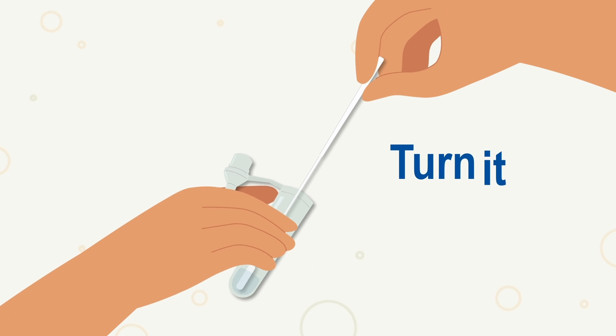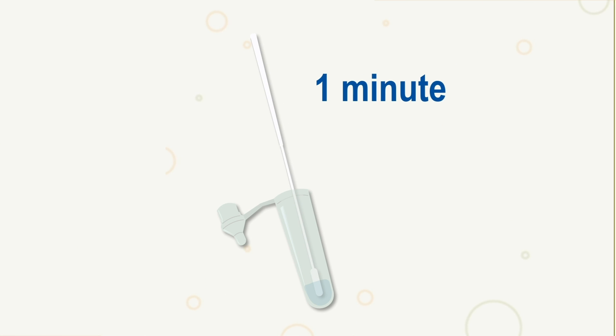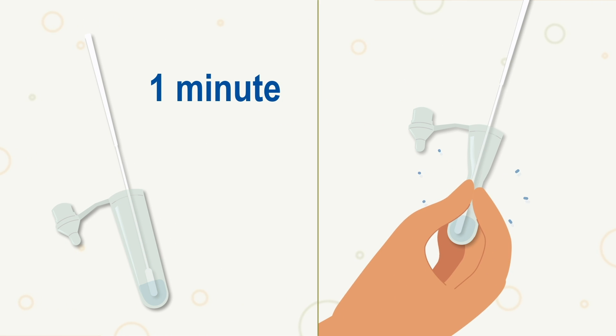Wait a few seconds and repeat the same process for your other nostril. Place the swab into the extraction tube. Turn it and leave it for one minute. While removing the swab, pinch the tube with fingers. Leave as much solution as possible in the tube. Close the tube.